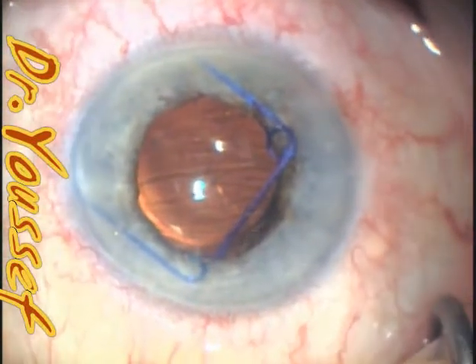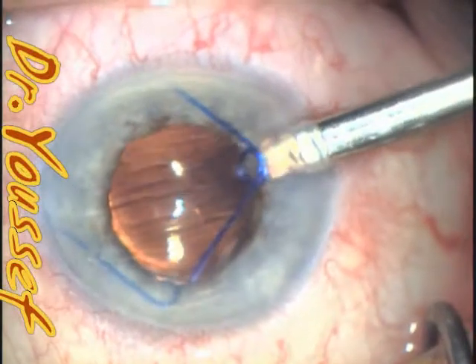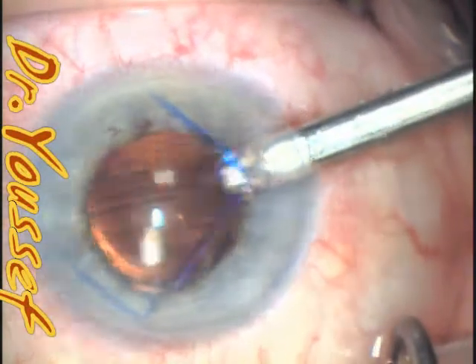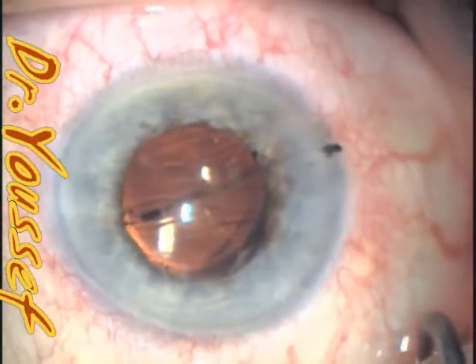So the upper one, sub-incisional one — and then the inferior one is the one that goes out with the cartridge. So I'll hold it. And it's very important to hold both parts of the ring, not just one part, otherwise it will hook the wound. And you don't have to draw it completely into the injector.